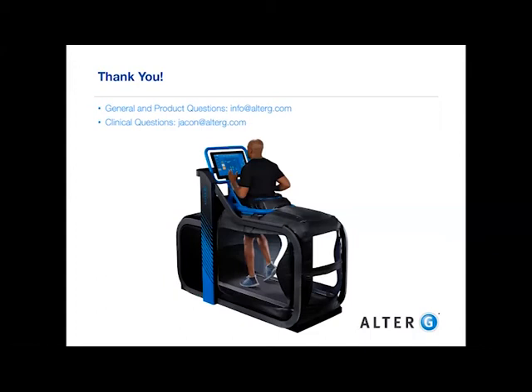If they've got an active DVT, again, these patients probably wouldn't be doing therapy. And then if they have cardiovascular hypotension, so if they've got low blood pressure, the reason for that is there's a little fluid shift from the lower extremity to the thorax. And so when they exit the treadmill, we don't want the fluid to shift back too quickly to the lower extremities, which might lead to an episode of syncope or fainting. So those are really the only three contraindications. Again, I always tell people it's not if patients are appropriate, it's usually when.